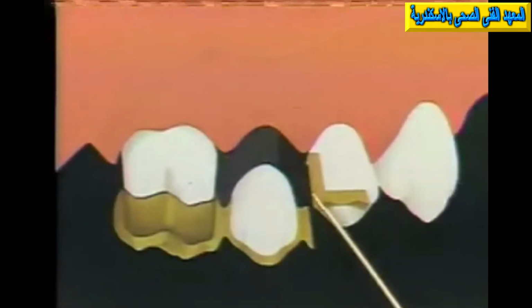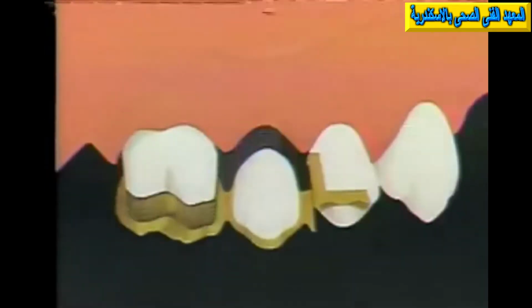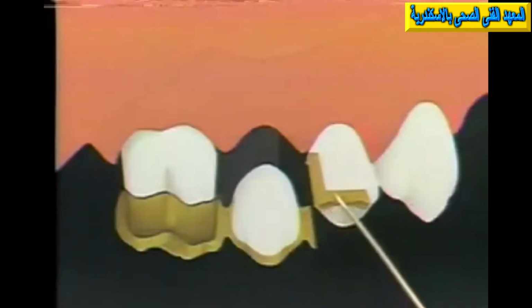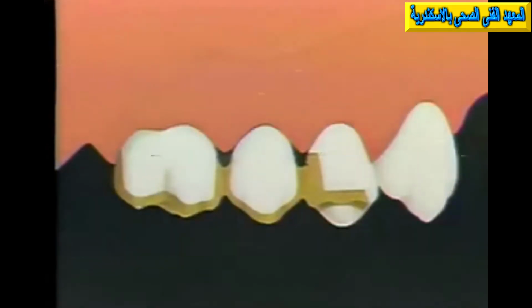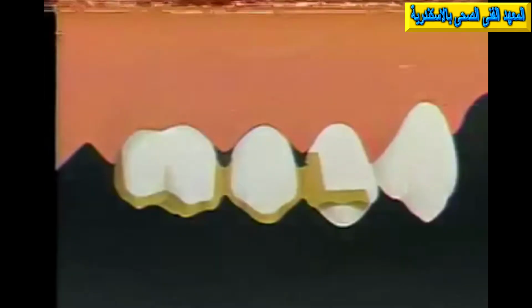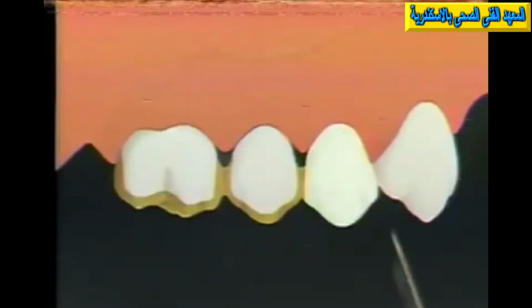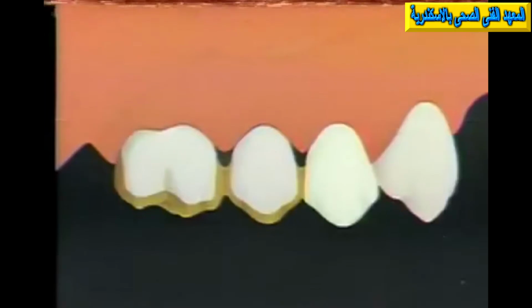It doesn't appear retentive here, of course, because the retentive form is in the labial proximal box wall, which has been cut away. This breaks the stress. It allows a little bit of movement between the posterior part of the bridge and this retainer here, so that this will remain satisfactorily cemented in position during normal function. Now, if we place back again the labial surface here, I think you see once again the advantages of that type of retainer in this situation. No gold exposed on the mesial, the labial, or any of the margins in that situation. So this then is the use of the semi-rigid connector to enable the use of a simpler two-surface retainer in this particular bridge case.